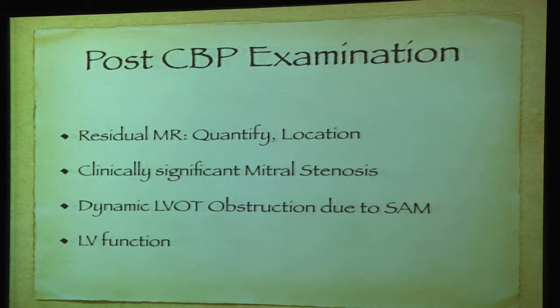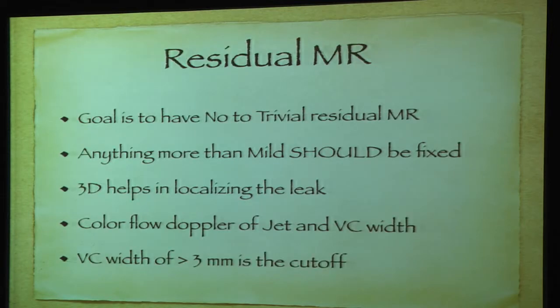So post-bypass examination, your focus should be residual MR, if there is any, to quantify and localize that. If there's any mitral stenosis, you quantify that. Any SAM, and LV function. Those are the main 4 things that we focus on. The goal is to have no to trivial MR. Moderate or severe MR is not good.